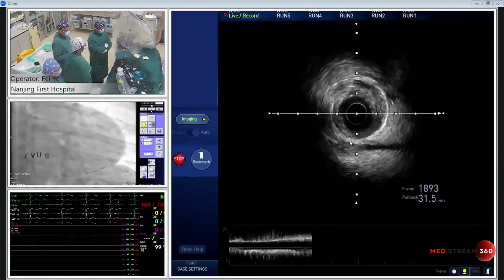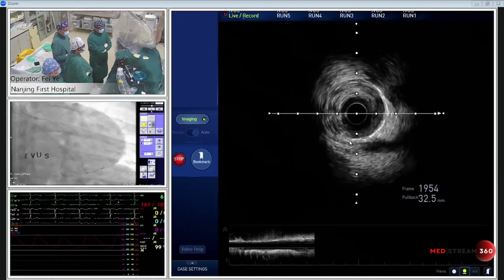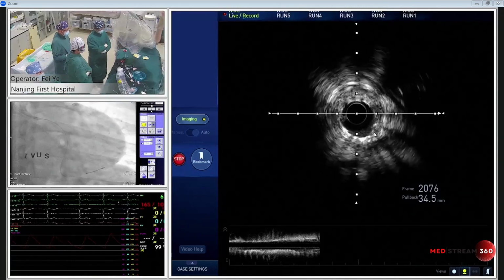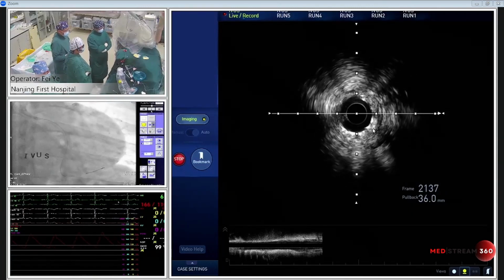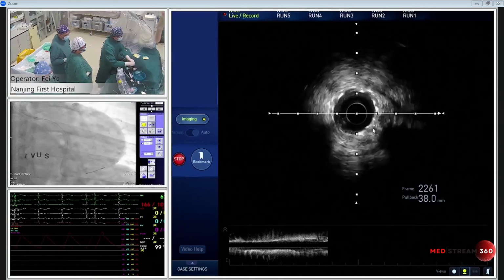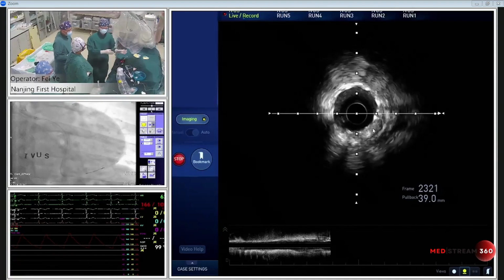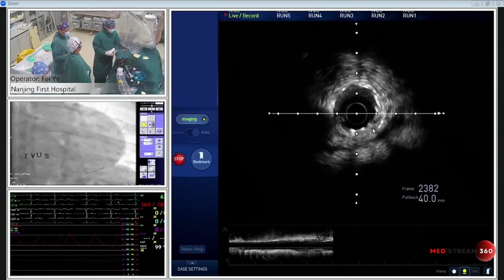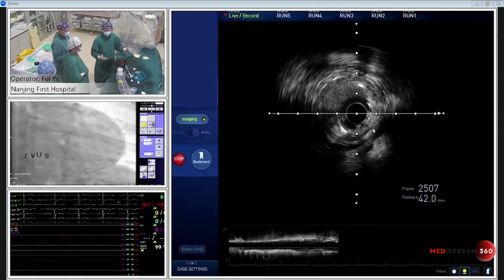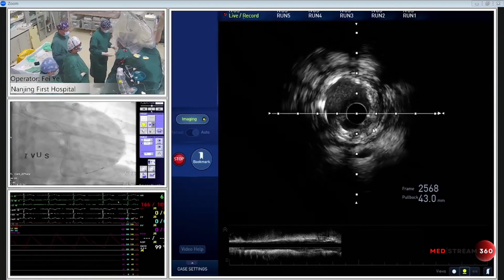Small dissection. Yes. I think I need a small dissection. Just at this stage. Maybe we should put another small stent, depending on whether there is a landing zone. Okay. Diffuse lesion in the distal. If there is no suitable landing zone, TIMI flow is good.